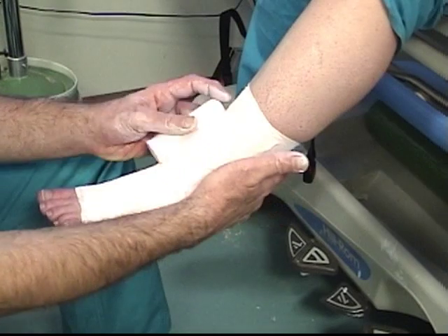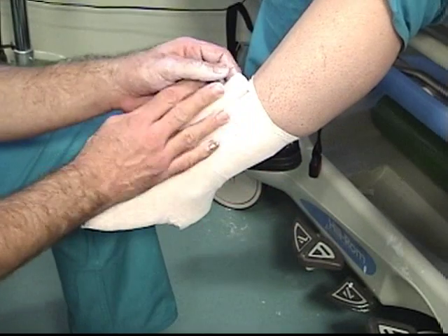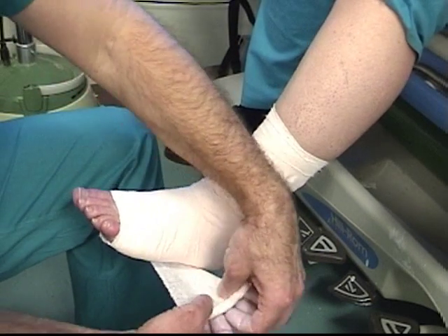In areas where there are excess amounts of the wrap due to changes in the wrapping angle, simply fold in the Unaboot material to allow for compensation of these excess segments of the wrap, as shown here.